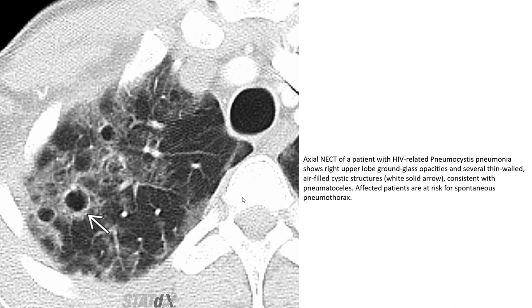On non-enhanced CT, the right side shows patchy ground-glass opacity and several single air-filled cystic structures, consistent with pulmonary pneumatoceles. The patient is at risk for spontaneous pulmonary complications.